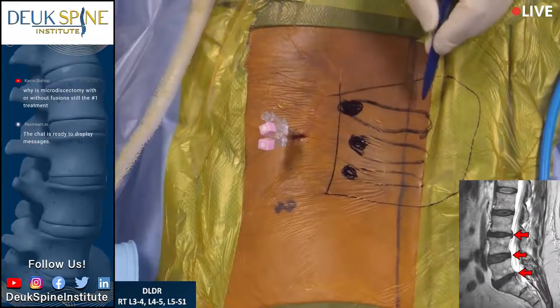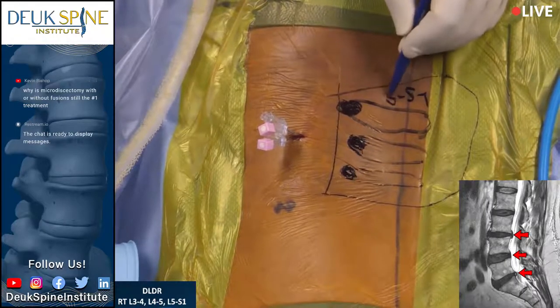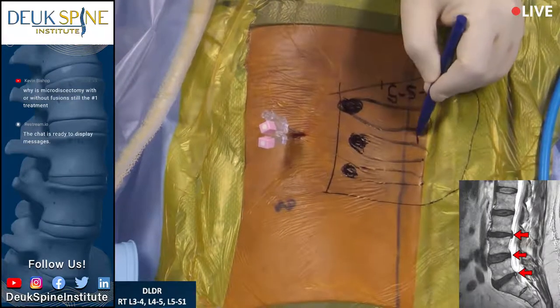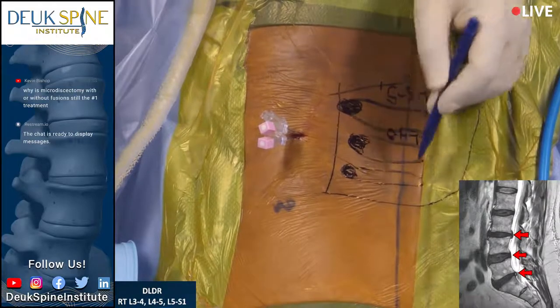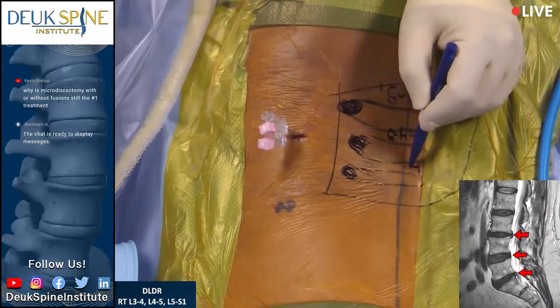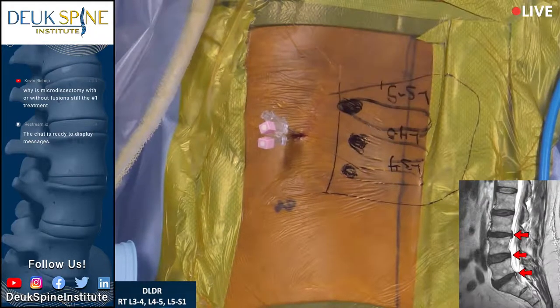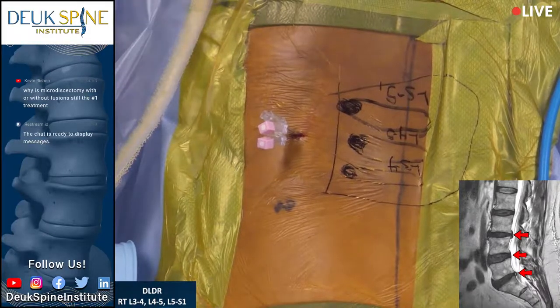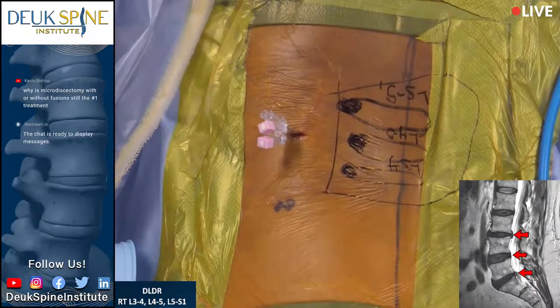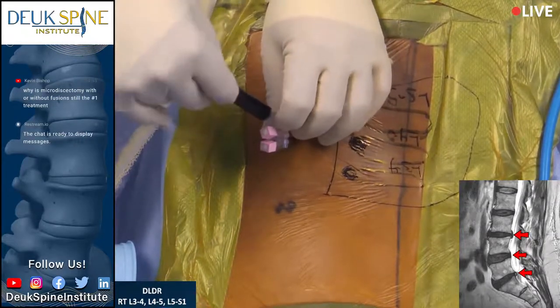All right, and the first one is the L5-S1. This one is the L4-5. And the last one here is L3-4. We're going to check each one, okay? I don't think we're ready for the laser yet. Let's turn that off.